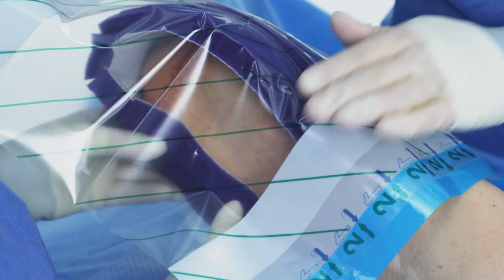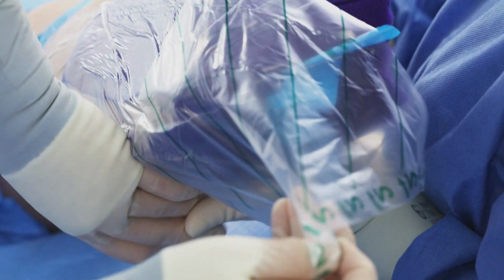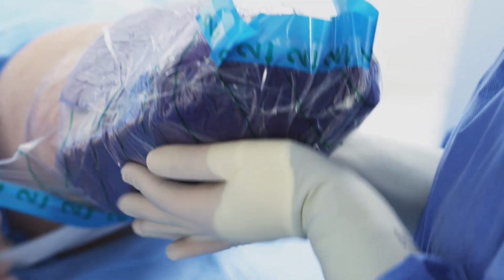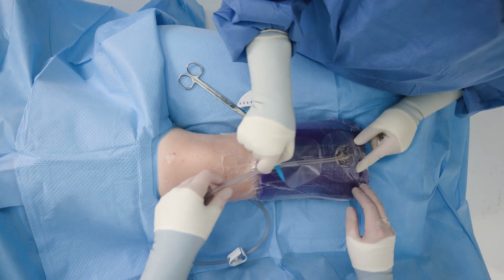With your Prevena dressing, it's important to run your fingers around the edge of the dressing when applying and make sure to avoid stretching the material. Do not stretch the dressing or film during application, as tension can cause skin damage, such as tension blistering.